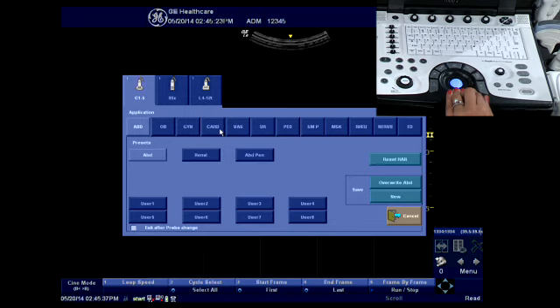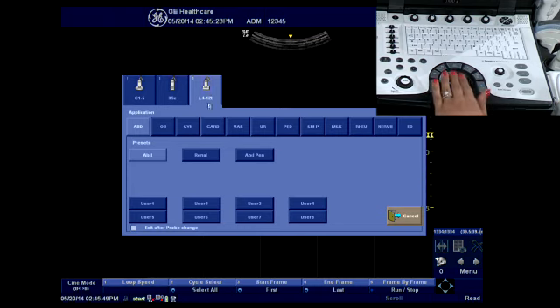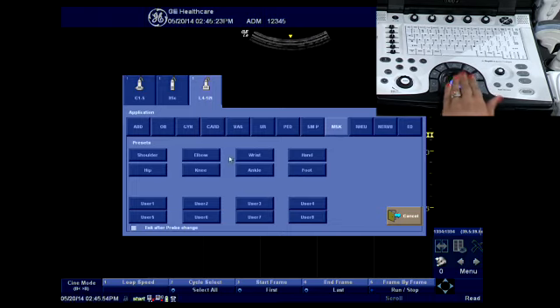Let's say I would like to do a shoulder exam with the L4-12T RS probe. I will select my transducer using my Enter key, select the MSK tab, and select my shoulder exam type.